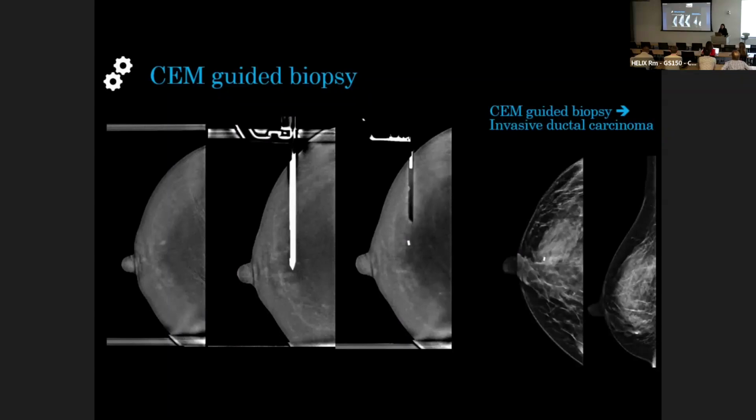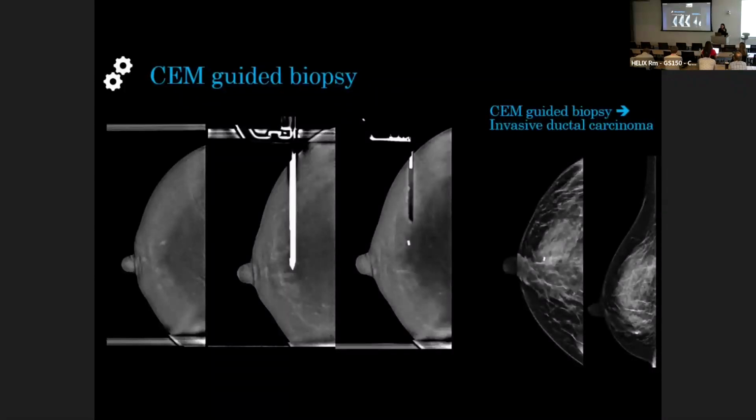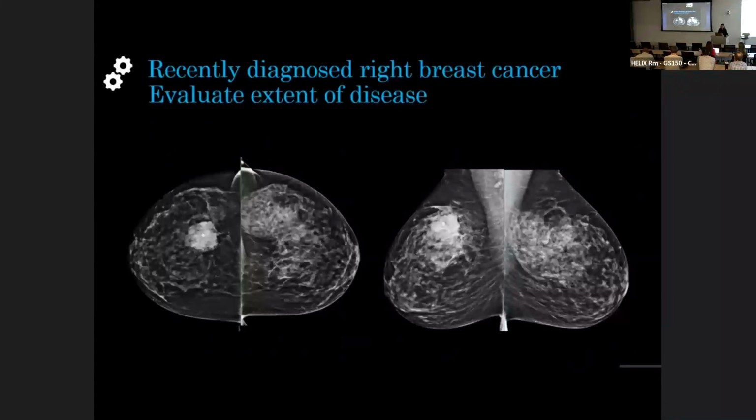So you sample the finding, and then of course, once you sample the finding, you don't have a means of checking the sample to see if you have an enhancing mass within it. We do post-biopsy mammograms on all of our patients, but you have no way of checking whether you actually got the finding. So we place the clip and then just get our standard post-biopsy views. We always get a post-biopsy tomo on all of our patients just to confirm positioning. So you just have to trust that you're in the right spot. And so far, this has worked really well. But of course, I'm sure we'll encounter challenges eventually.